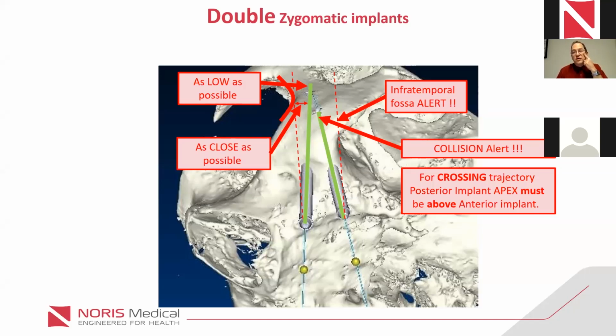The surgeon should put a finger, and he should drill until he feels the drill perforating the bone, and until he feels the drill in the finger. And there are two reasons for that. First of all, in this way, we know that we actually use the whole length of the zygoma bone, because if we did not perforate and we don't exactly know where we are, we might measure, and instead of having 2-3 more millimeters of bone, we are short of that bone.